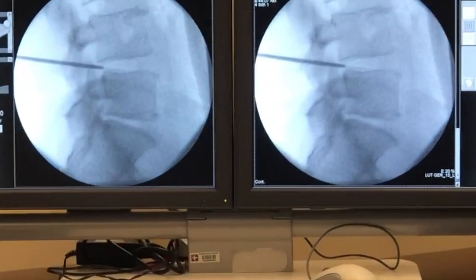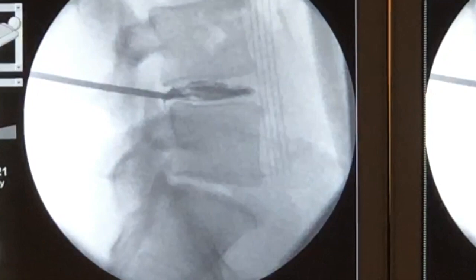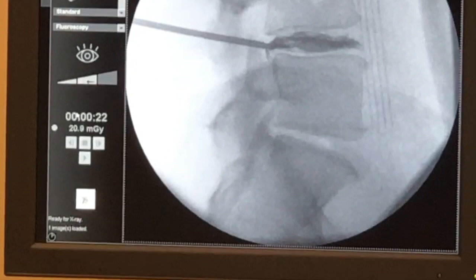Here on the chromodiscogram — shot and save — looking for a leak out the back. Shot and save, there it is right there. Shot and save, that's the annular tear. Shot and save.